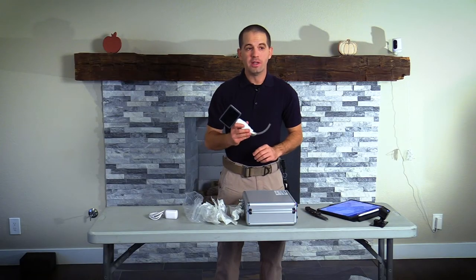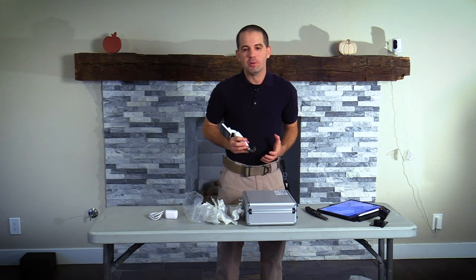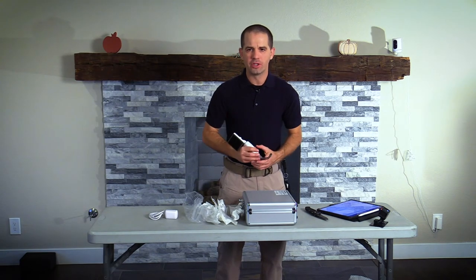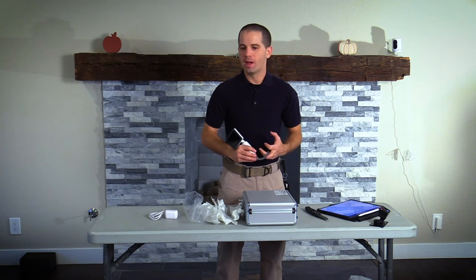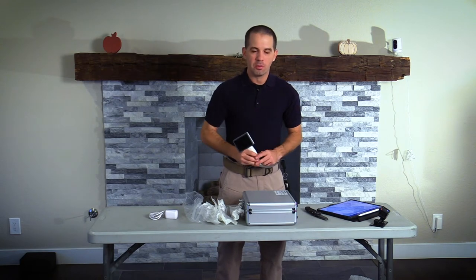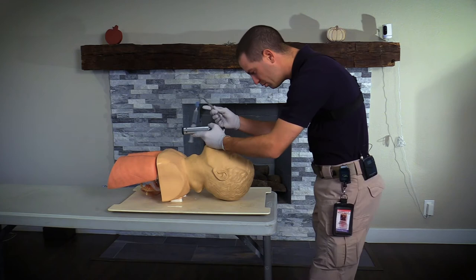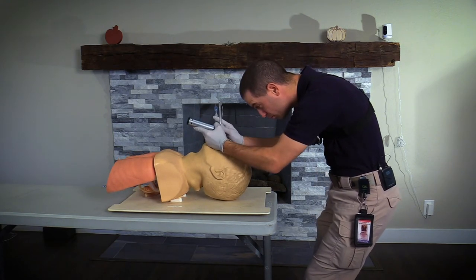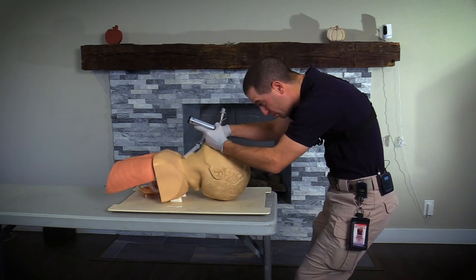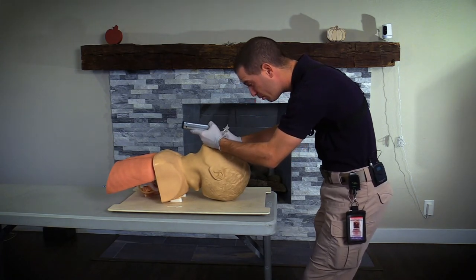By using a video laryngoscope, it puts the camera above the epiglottis. This is important for people who would be considered difficult intubations — obese patients, patients with a high Mallampati score — these are individuals that may be very difficult to intubate. With a manual laryngoscope, your eyes are much farther away from the glottic opening, meaning you must manipulate the airway more, which can lead to trauma.